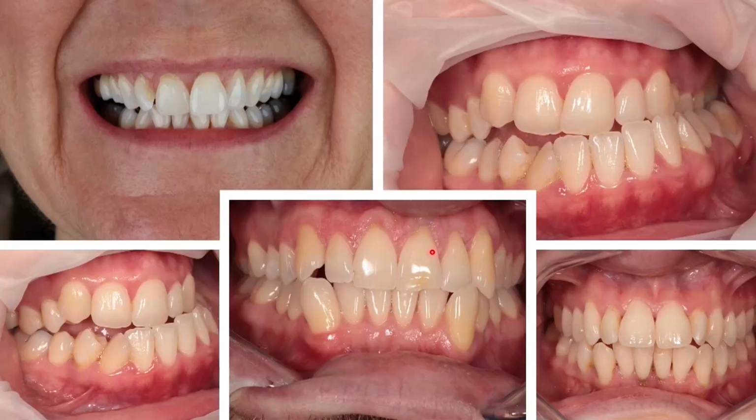And then the final photograph we can see on this screen here, on the face of it looks quite nice, but then think about the periodontium. We do talk a lot about gums in clear aligner work, and we can see some evidence of attachment loss down here and up here.